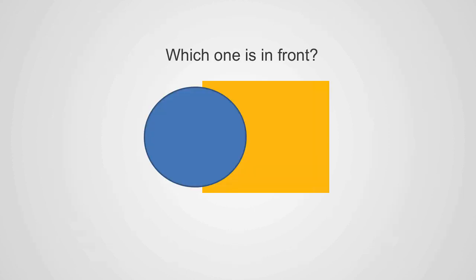If one rectangle is grayer than the other, and the two rectangles touch, we can still see them separately. They form an interface. Interfaces occur only if there is a significant density difference between the two adjacent tissues. Interfaces will occur when air touches a soft tissue density, or when air touches bone, or when soft tissue touches bone.